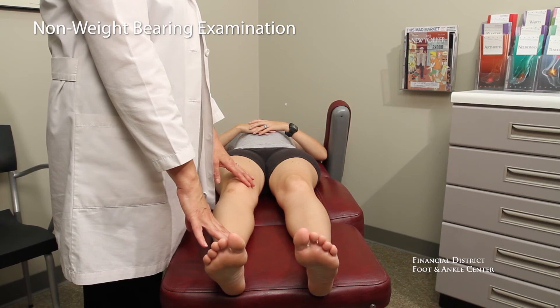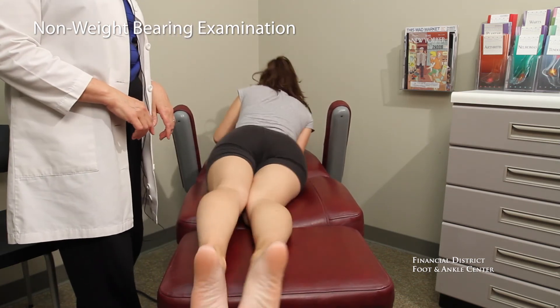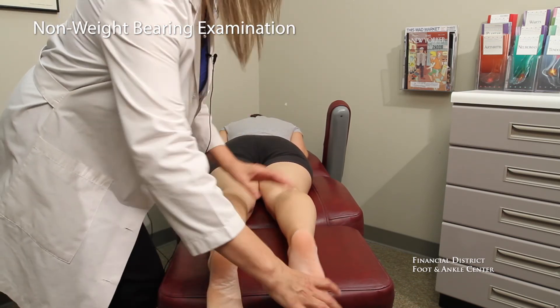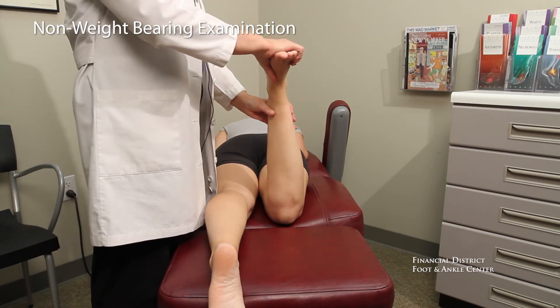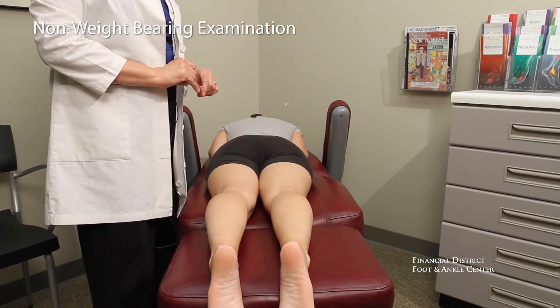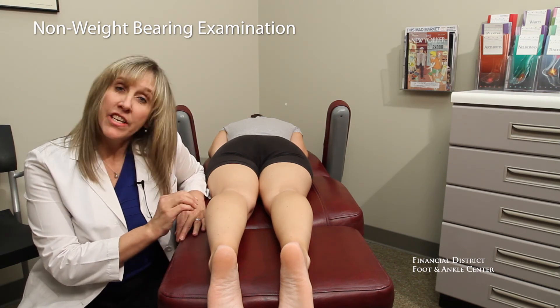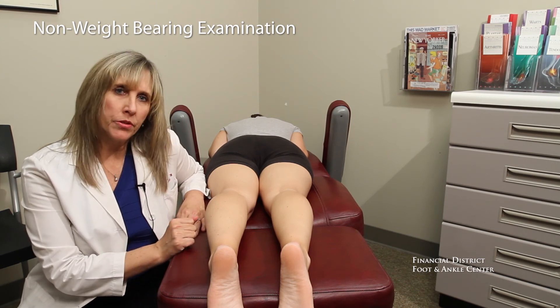Next, we'll have Shauna roll over and we'll take some face-down measurements, again comparing right to left and comparing normal versus out of the range of normal. By doing this critical part of the examination, we're actually able to prescribe the best orthotic based on an individual patient's alignment that we wouldn't otherwise be able to do.